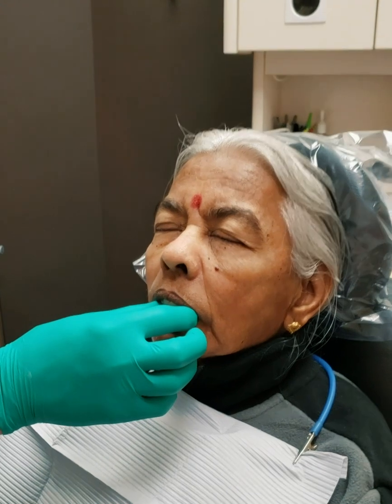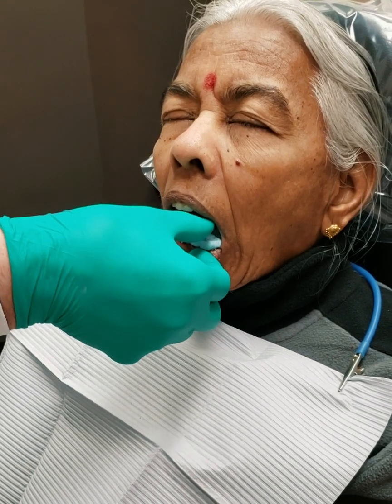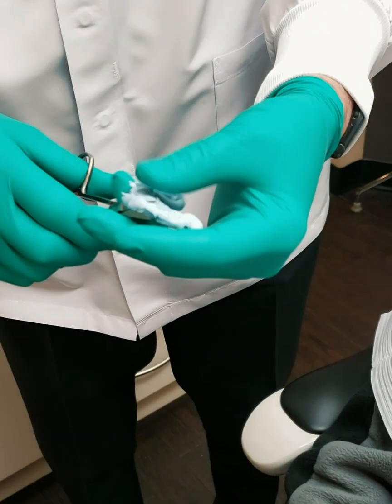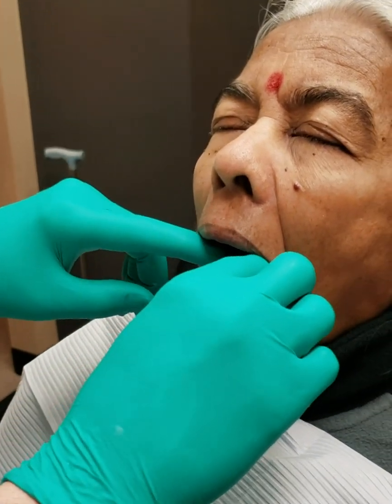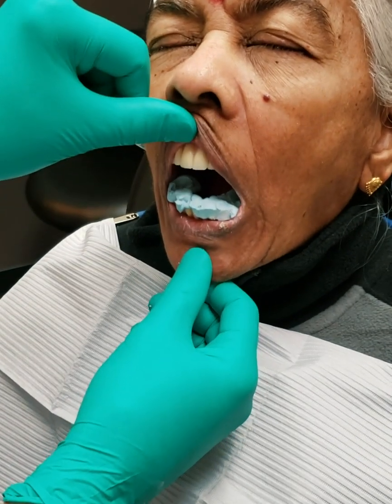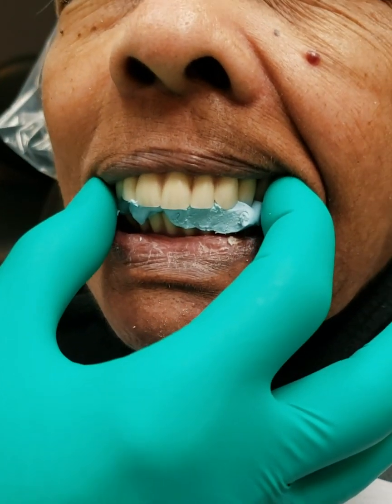Don't open. Okay, open please. What I like to do is cut off a certain amount of the anterior bite, reinsert it in the patient's mouth, close down please. You see the patient closes right into there. Open, please. Now we'll take a second one.